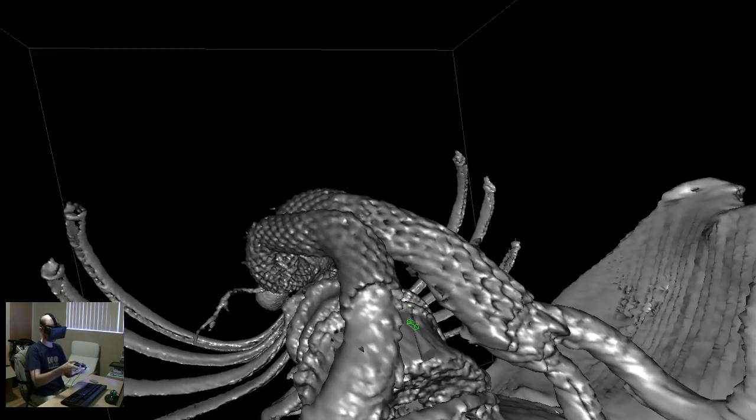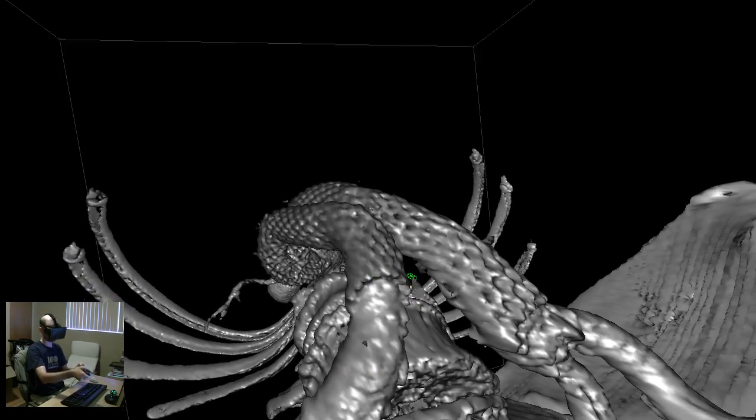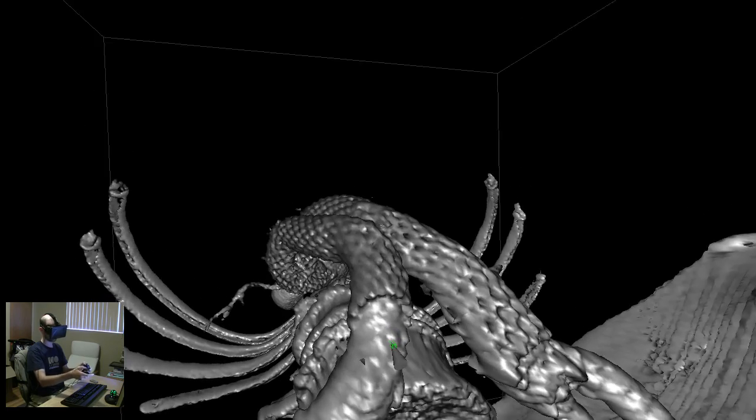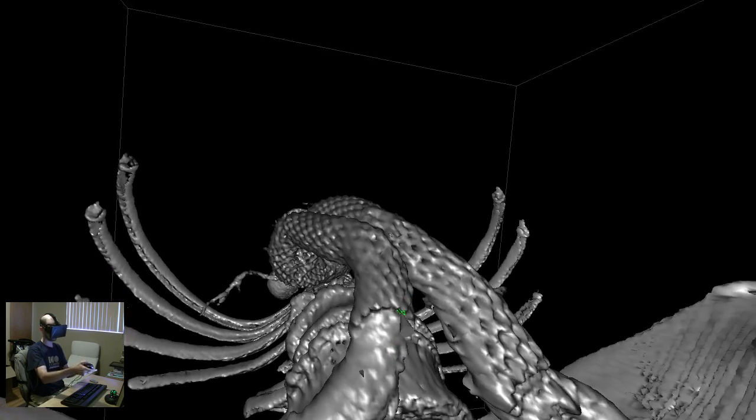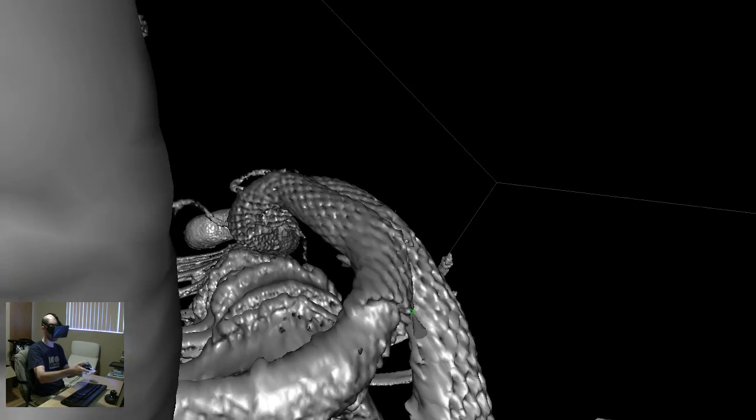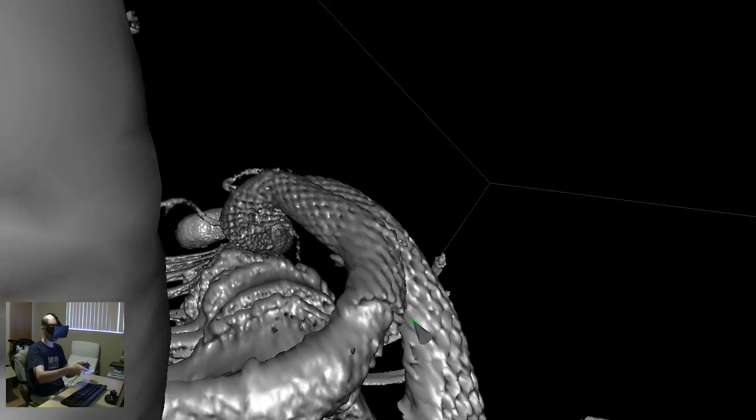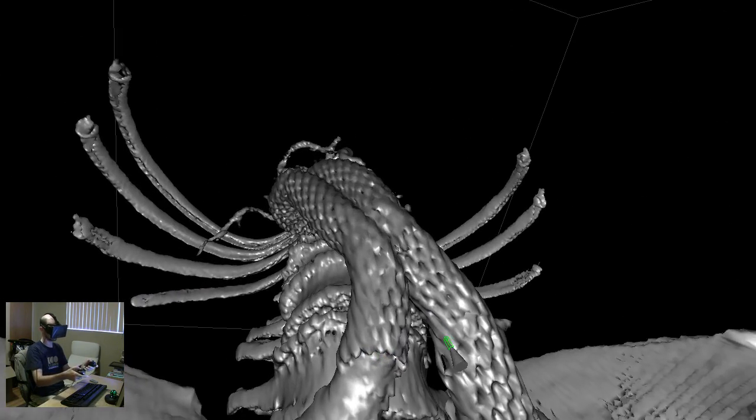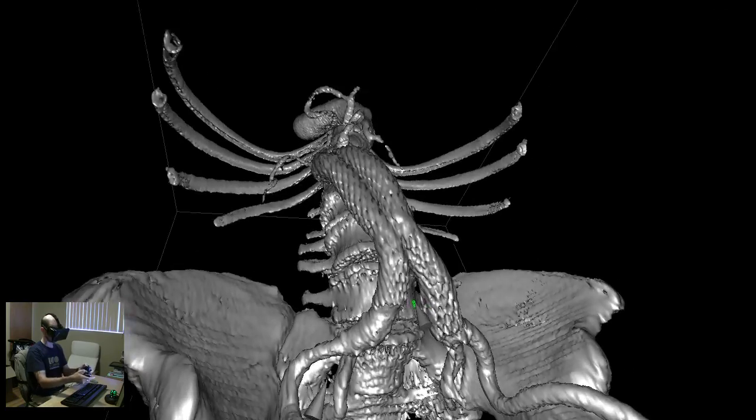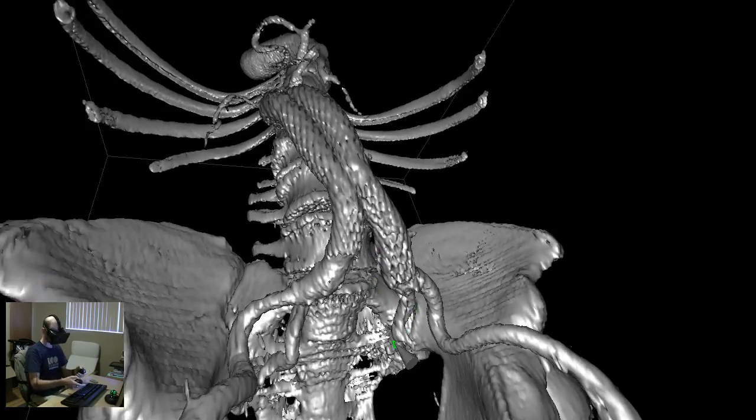What that actually means is what we're seeing here are not the blood vessels themselves, but it's the volume of blood running through the blood vessels, because that's where the contrast agent is. So when it looks like here that the stent is on the outside of the aorta, that's actually not right. The stent is on the inside of the aorta, but the blood flow is then on the inside of the stent. That's the purpose of it. And so that's why it looks a little bit funny right now.